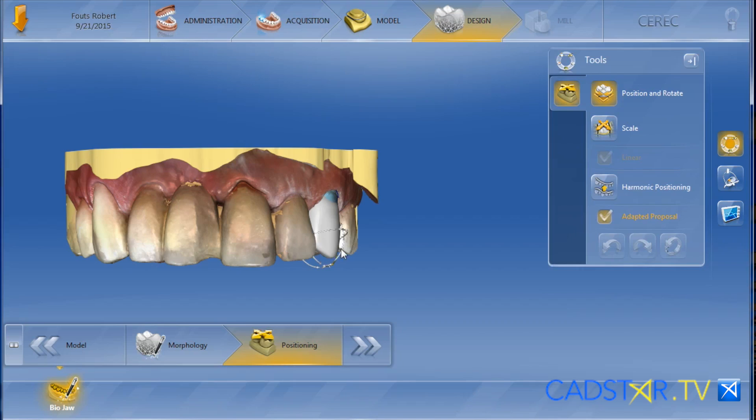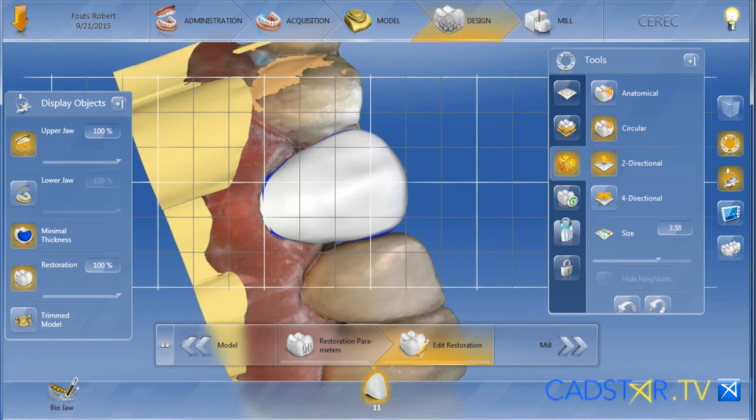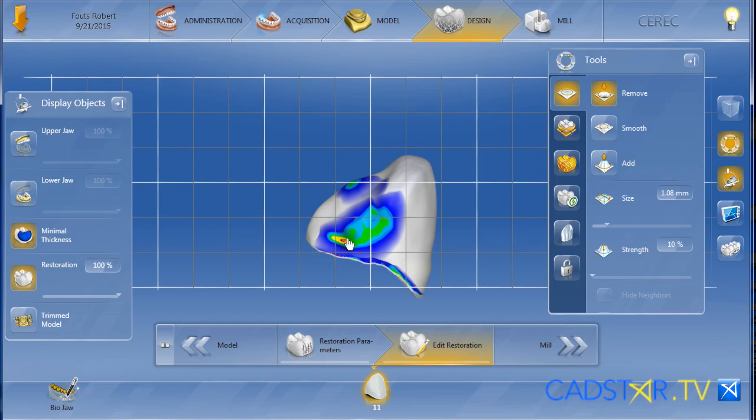You can use the BioJaw positioning tools to position the size and location of that tooth to make sure it fits the arch. So when you render into your design screen, all you have to do is make sure you check the emergence and finish the interproximal contacts, and you're ready to mill.